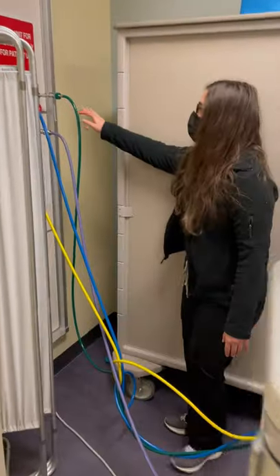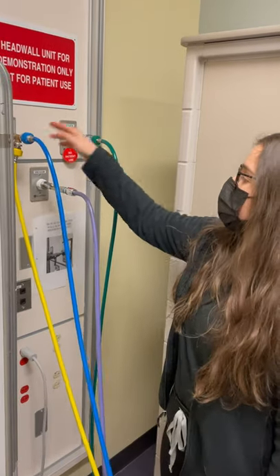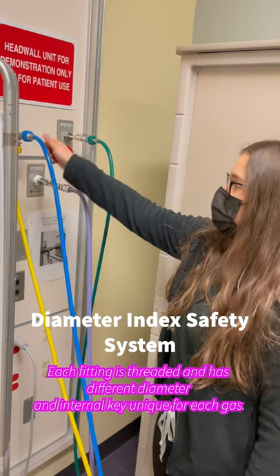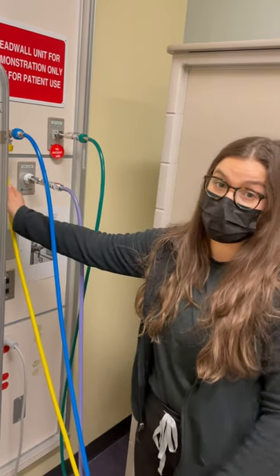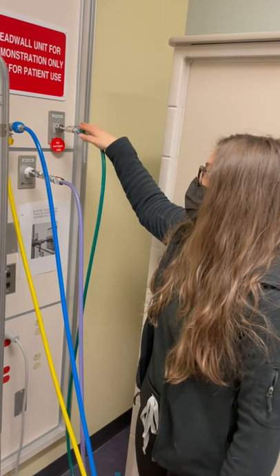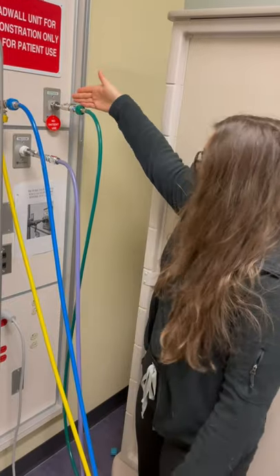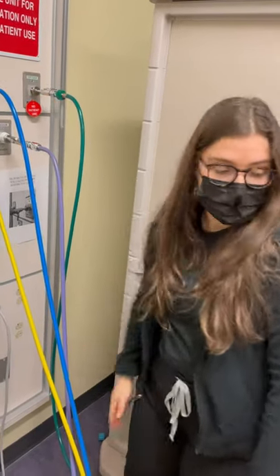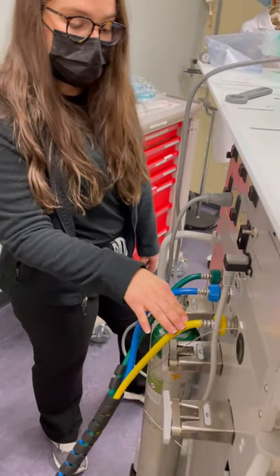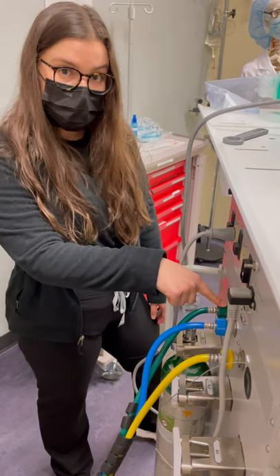I'm going to check the pipeline supply. Oxygen's on. This is called a diameter index safety system. The idea is that the diameter of oxygen, nitrous oxide, and medical air are all different — they're a specific threaded system — so you hopefully cannot put oxygen where nitrous oxide is and vice versa. The colors line up and this looks good. Same thing at the back of the machine: medical air, nitrous oxide, and oxygen are all lining up appropriately.